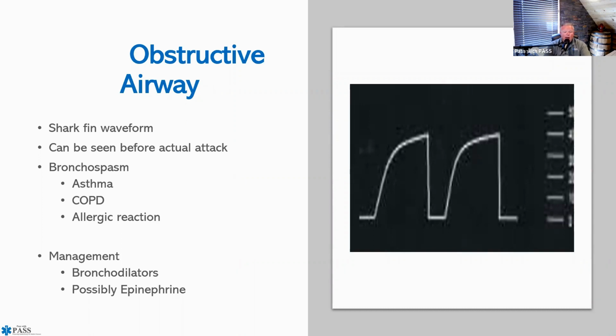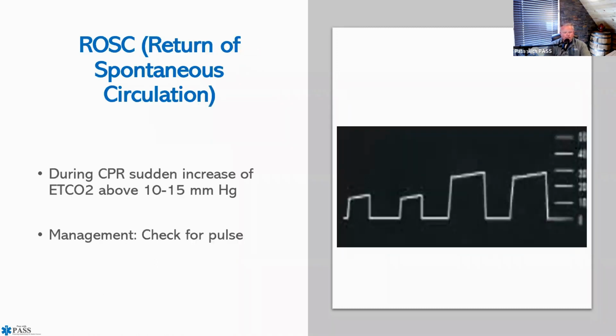So keep in mind, any of these obstructive airway patterns, it is a problem getting air out, not getting air in. And that is why, as we look at the exhalation waveform, it's tilted backwards, giving a shark fin appearance because it's just taking longer for them to exhale. Once they have finished exhalation, you can see very quickly that inhalation drops off and is basically a straight line back down to that respiratory baseline.